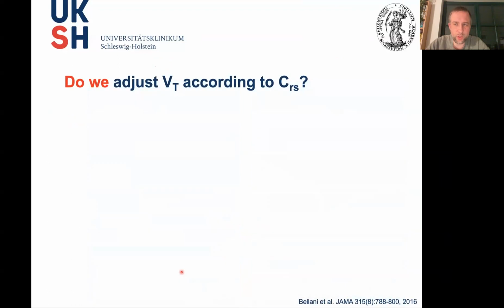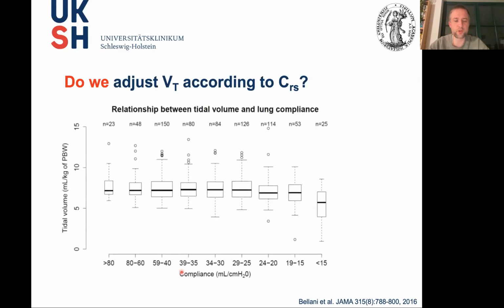But again, is this what we do in clinical practice? I already showed you that we do not really adjust tidal volume according to predicted body weight in many patients. So do we do it according to respiratory system compliance? According to the data from the LUNG SAFE study, again, not really. This is respiratory system compliance.